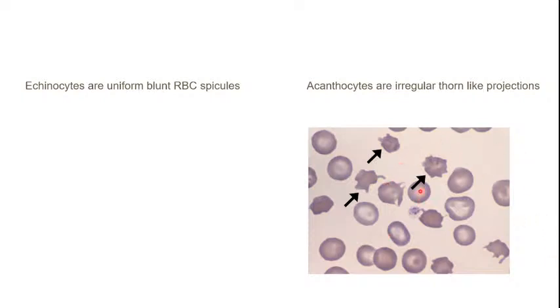If you remember your clinical microscopy classes, they would say ammonium biurate crystals are characterized as thorny apples. Basically, they have the same appearance. And what sets them apart is the irregular projections. There is no uniformity to it.